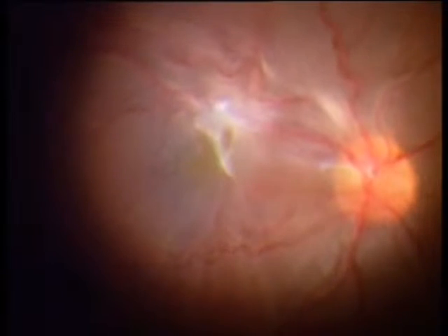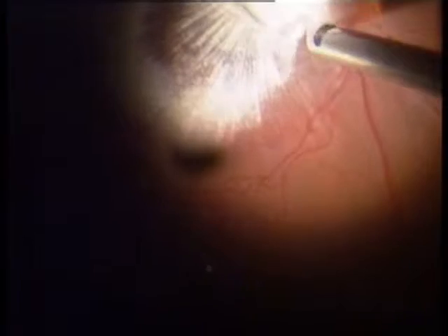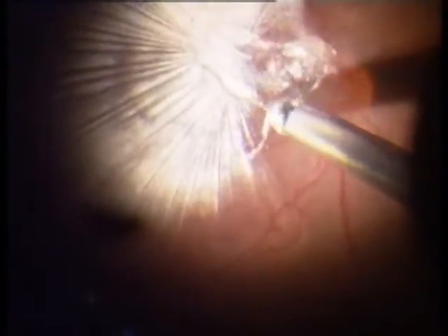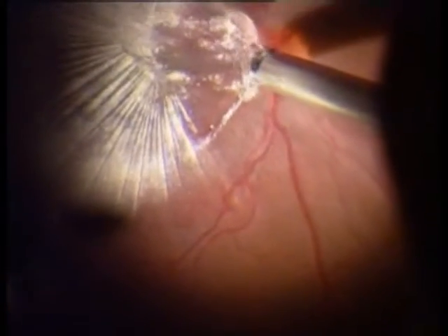This is another case of epiretinal membrane with a pseudo-hole-like formation using triamcinolone. We inject triamcinolone into the vitreous cavity, and after removing the residual triamcinolone, what we see is the staining of the hyaloid and also staining of the strias created by the epiretinal membrane in a C-fan-like manner.